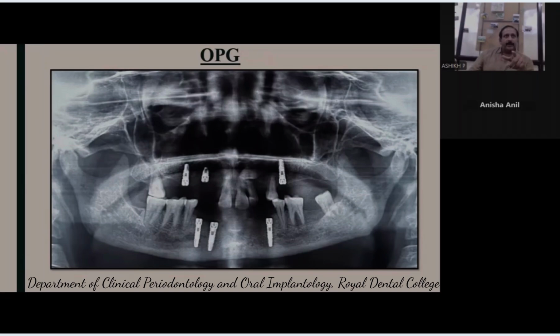If it was a diverging one, bifurcating in a very obtuse manner, then definitely you would have had a socket that is much larger than what you see in a normal view here. You would have had a mesiobuccal root in the area where you're planning an implant. That is not there, I believe. You've got a socket harboring a conical root, so there's not going to be much interference from any roots which are possibly divergent in some other case. But here you can see roots which are conical, fused to each other.